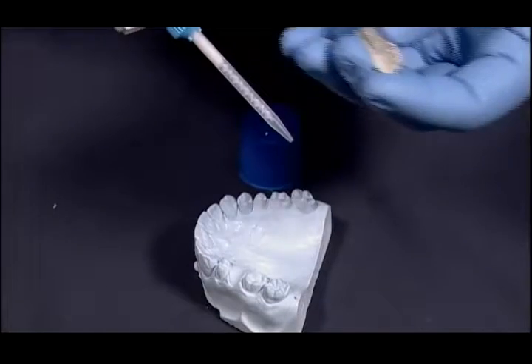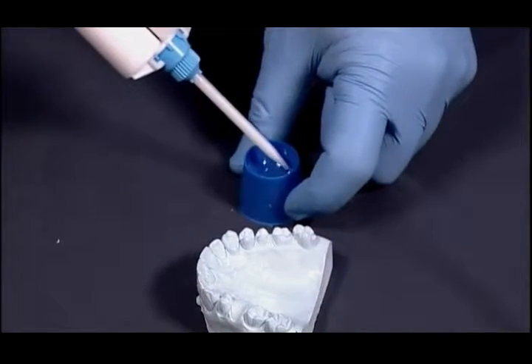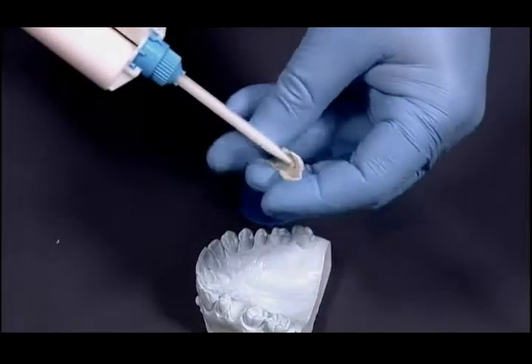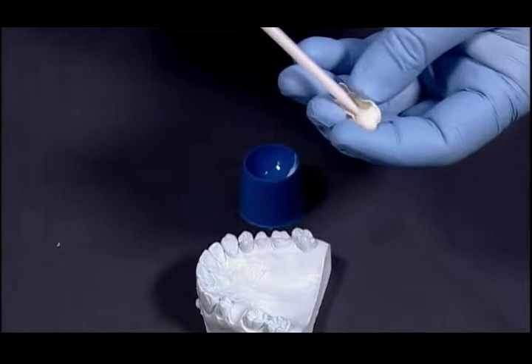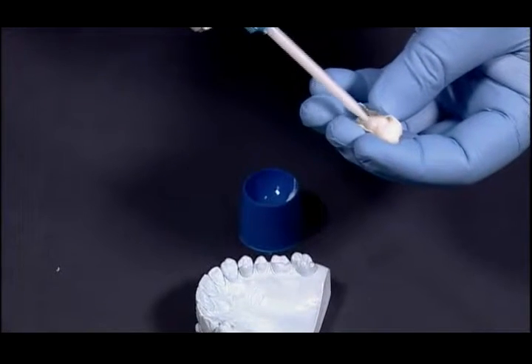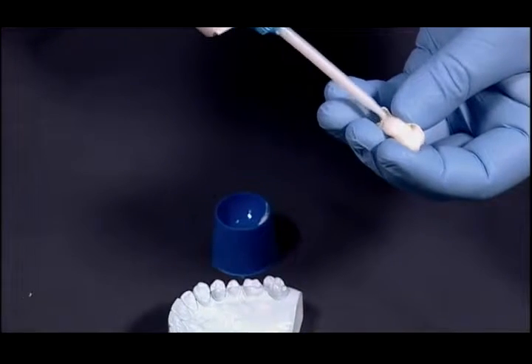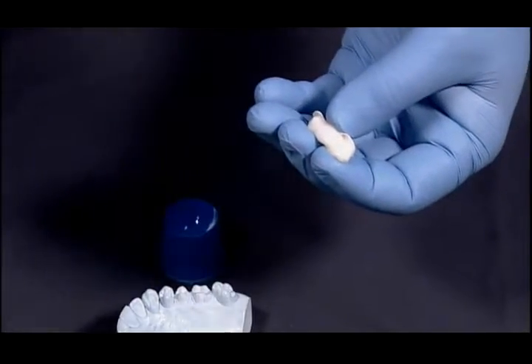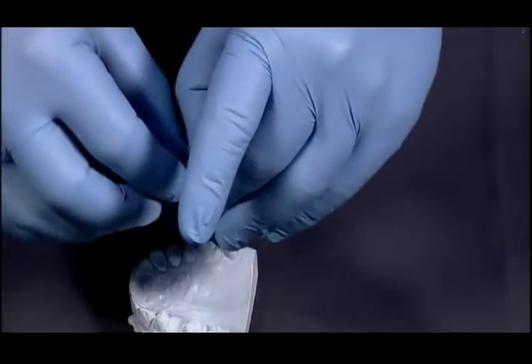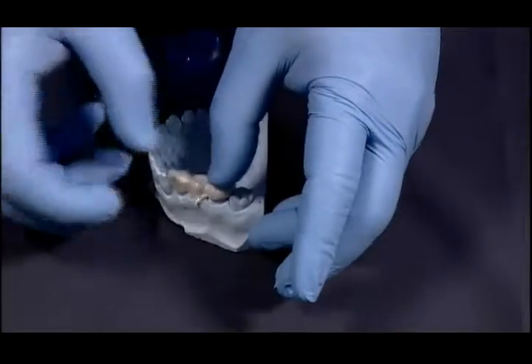You'll see it mixing as it goes through the syringe tip. What I would recommend is just take a small amount and express it out first so that you make sure you have a good quality mix, keeping the tip down inside of the Bis Acryl material. Because we're doing a pontic for this bridge, I want to make sure I've overfilled in the pontic area so we fill right down to the gingiva. And we'll go back to the patient and place the restoration onto the model.